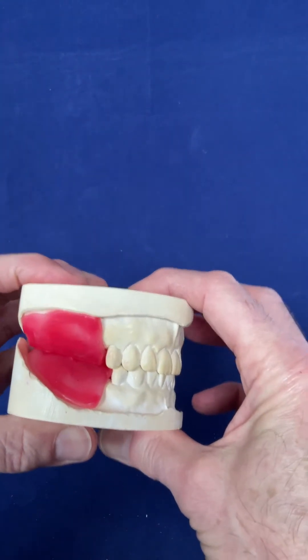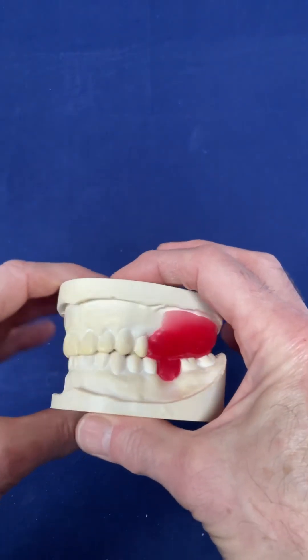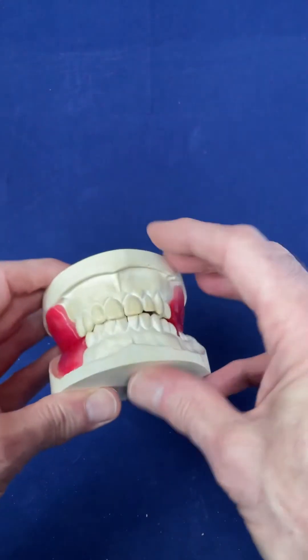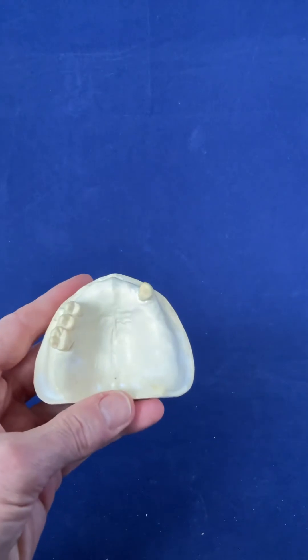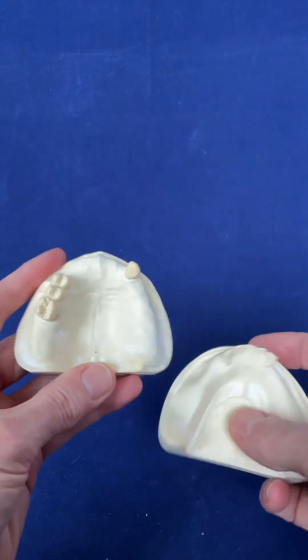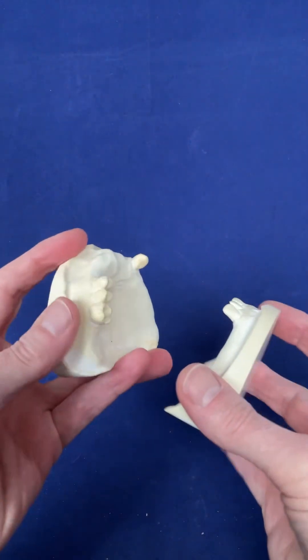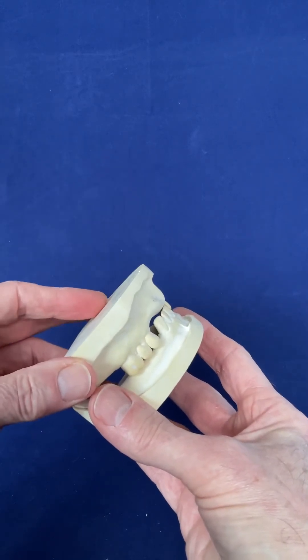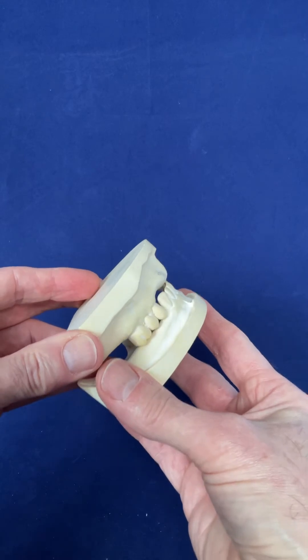With the lower occlusal rim in place, when the patient occludes to intercuspal position — centric occlusion — these two teeth still intercuspate, but now you've got posterior support so you cannot get this wrong. Centric occlusion is perfectly okay here, as is centric relation, because this is a reproducible jaw relationship. Now for the worst-case scenario: a patient with a number of edentulous saddles.